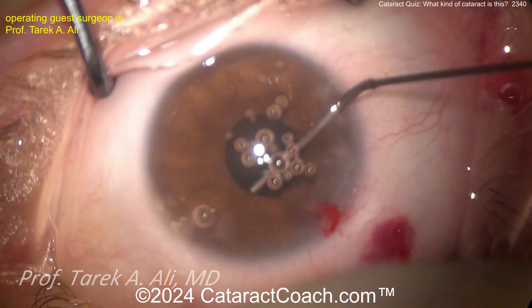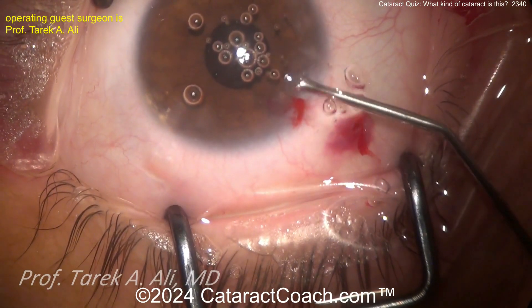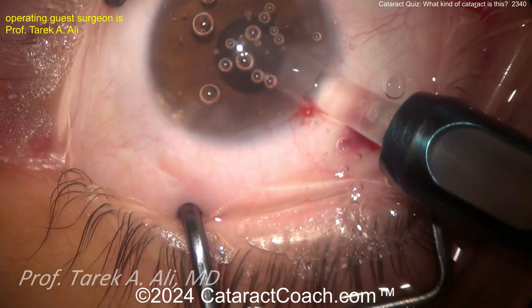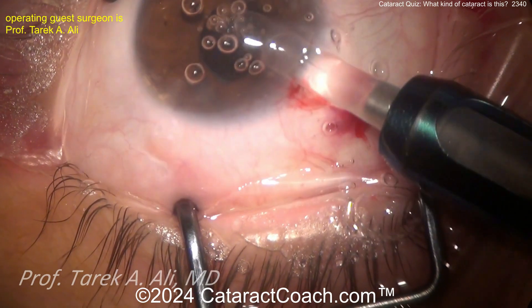Ideally I'd like to have the new lens in the capsular bag again. I can't tell if the posterior capsule is intact — that's going to be a challenge because the patient had a lot of synechiae. The good part is, if you put in a hydrophobic three-piece acrylic lens in the sulcus, then the iris tends not to stick. There it is — the three-piece lens.